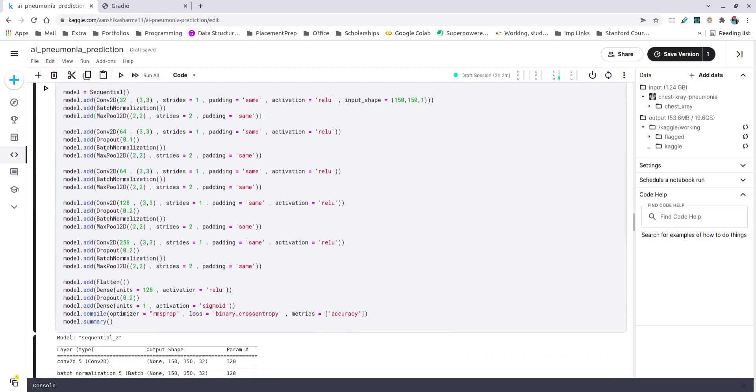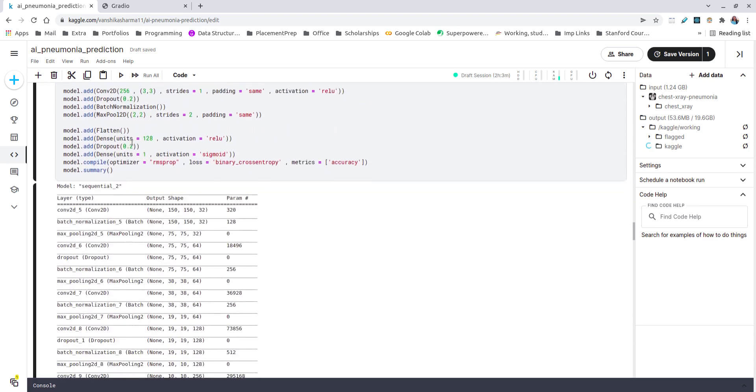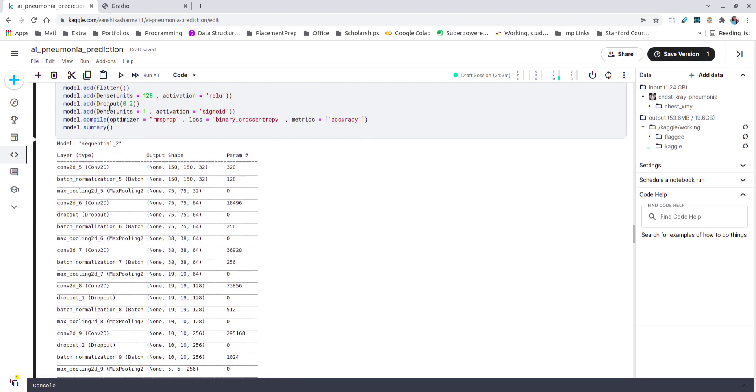At the end of every layer I'm doing max pooling, which is a way to reduce the dimension of the matrix. There are two types of pooling—max and average. I have added max pooling here to generate a feature map. It's just picking out the maximum from the matrix window and again generating a feature map for the next layer. My last layer is a dense layer of sigmoid activation function because I am trying to do binary classification. That is why I wanted to map my prediction into zero or one, and that's why I chose sigmoid as my activation function. For the optimizer, I am using RMSprop and a loss of binary cross-entropy, which is the classic loss we use in the case of binary classification.